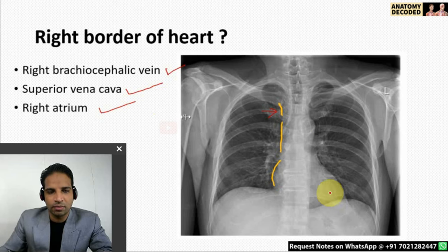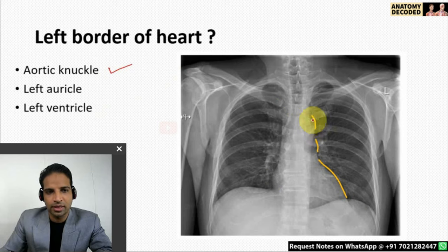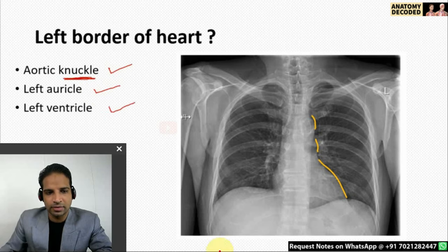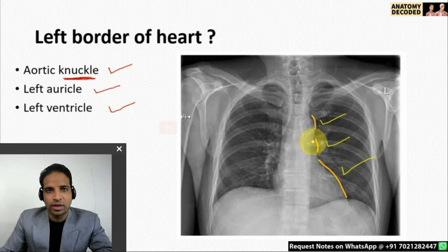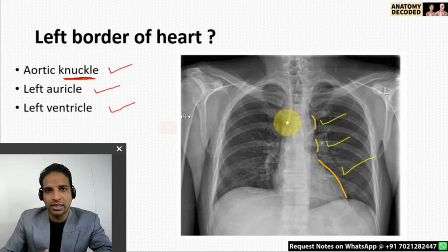Let us see the structures forming the left border of the heart. Again from superior to inferior, three structures are listed: one is the aortic knuckle — the bending of the arch of aorta continuing as the descending thoracic aorta. That region is referred to as the aortic knuckle. Then there is the left auricle and left ventricle. Three structures form the left border.